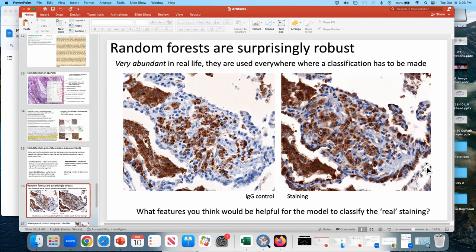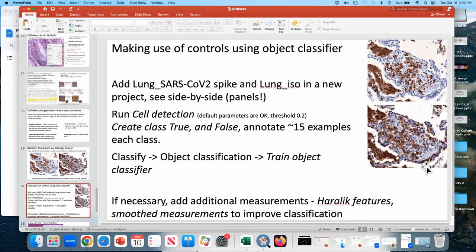A little bit? There are those little granules inside. Okay? And you can actually see it on the screen. I'm sorry, you're hopefully going to be able to see when you open the images on your computer. But this is looking more membrane-like, and this is looking pretty granular. There is one set of additional features in the software that allow you to see the texture. The answer is here. Haralick features and smoothed measurements might improve your classification because those cells tend to cluster together, right? They're either along the edge or they're in the central block.